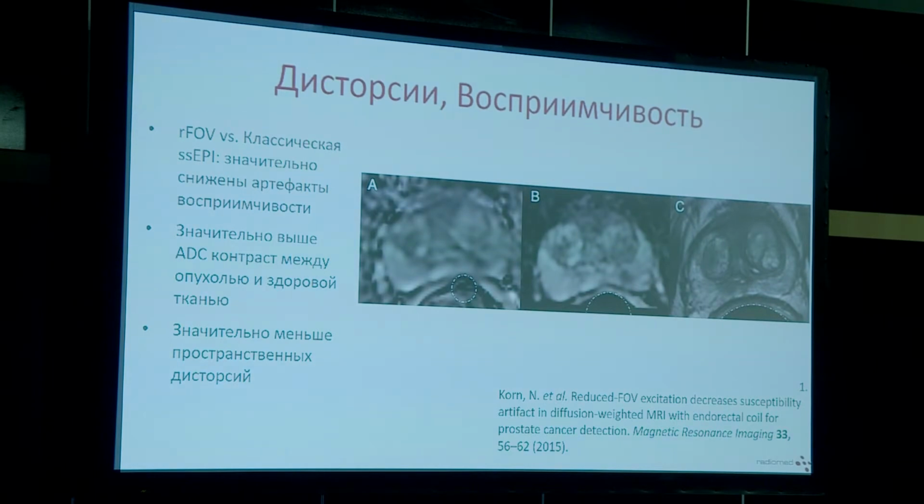This is taken from another publication. It again compares the extent of spatial distortion in single shot epi compared to focus diffusion, and you can see there's more distortion in the single shot epi approach than in focus. So why is that important?